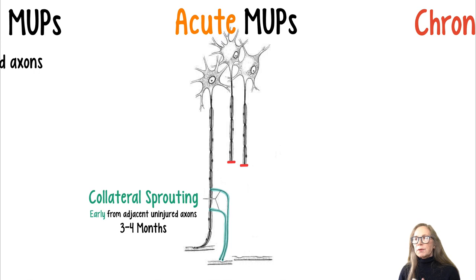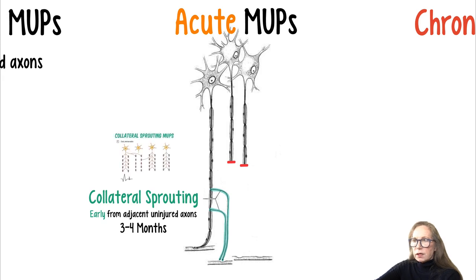So the injury can be up at the brachial plexus, and you can have no biceps function, but at 3 months, several inches down from the injury, you start to see some motor units arriving. That means that uninjured adjacent axons are collaterally sprouting to innervate motor end plates in the biceps muscle. Here's a little cartoon of that.